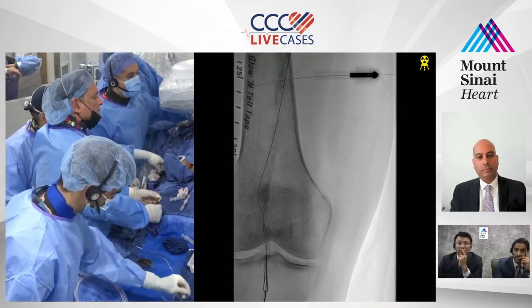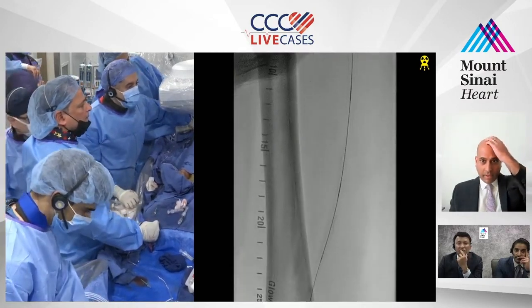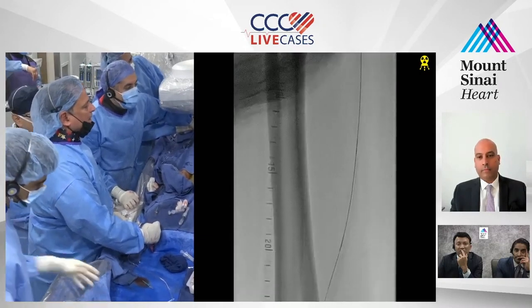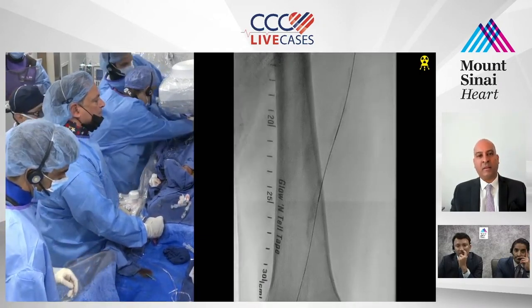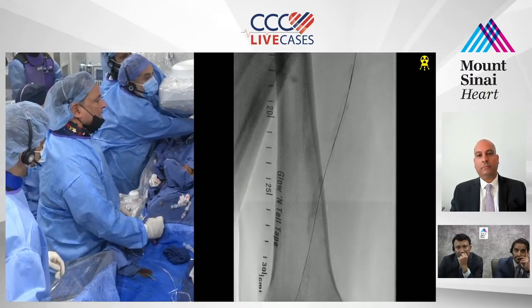The problem is we can't. Hold on, I have to track my catheter down. Can you look up top, guys? Yeah, there we go. That's what I'm saying, it's probably the issue we're having. I got the rail. She just has a panus, so it kind of kinks the catheter. It's coming slowly. Let me hold it. Let me flatten it back here.